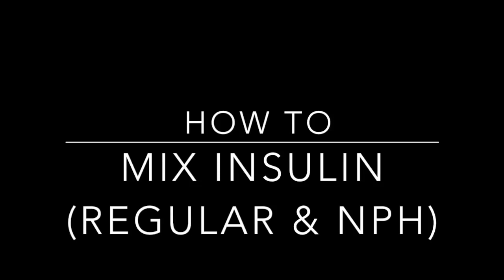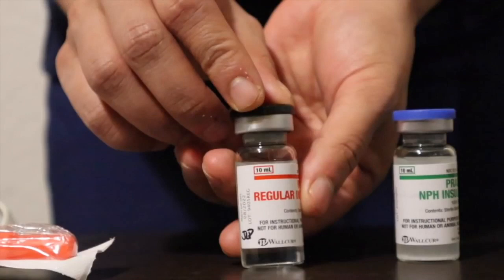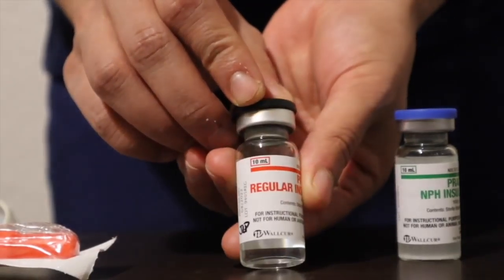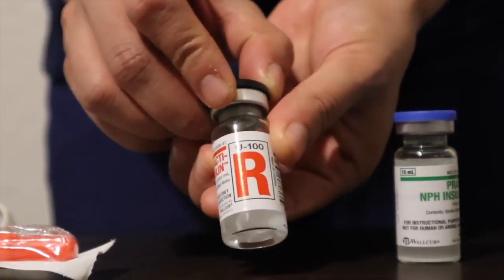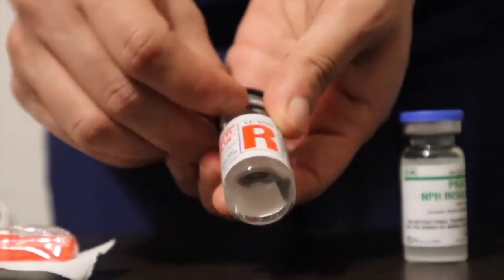Of course, like always, prior to the skill, wash your hands and use hand sanitizer. So typically insulin comes in a vial. As shown here on the screen, the vial on the left with the big red R is regular insulin, and at the bottom the solution is clear.